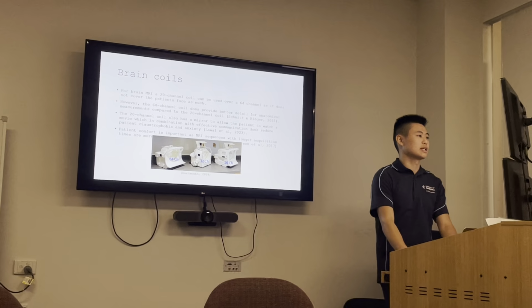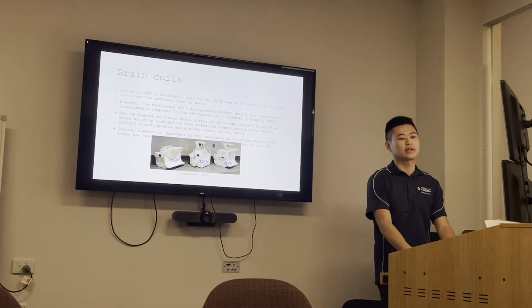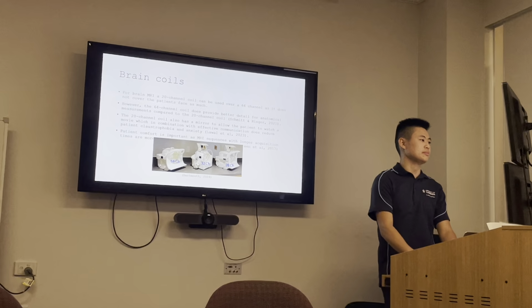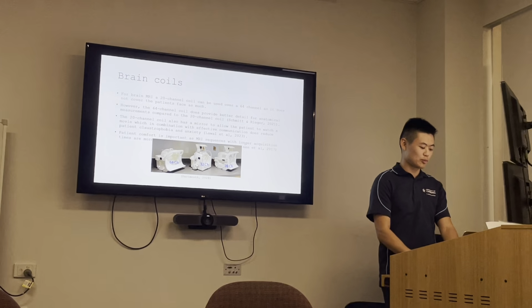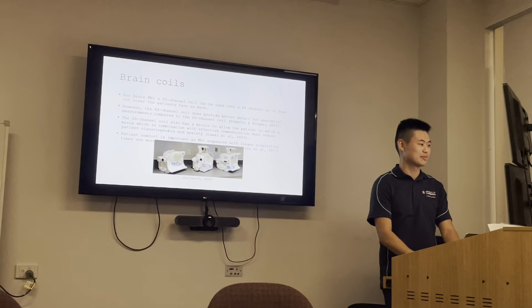The 20-channel coil also has a mirror which allows the patient to watch a movie, which in combination with effective communication does reduce patient claustrophobia and anxiety. Patient comfort is important as MRI sequences with longer acquisition times are more prone to movement artifacts, which is just on there.